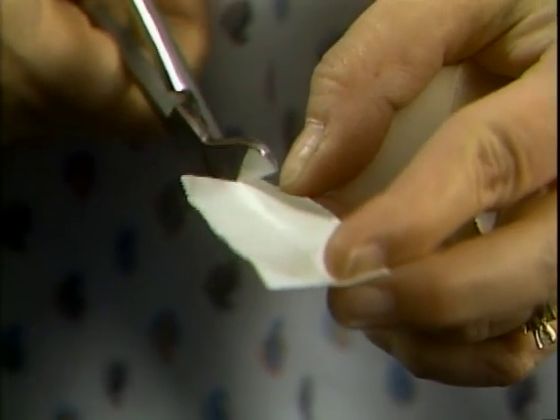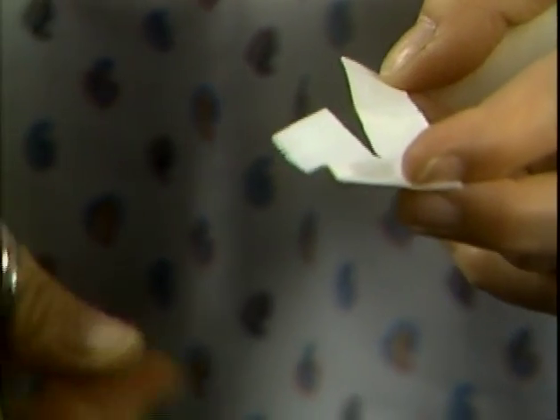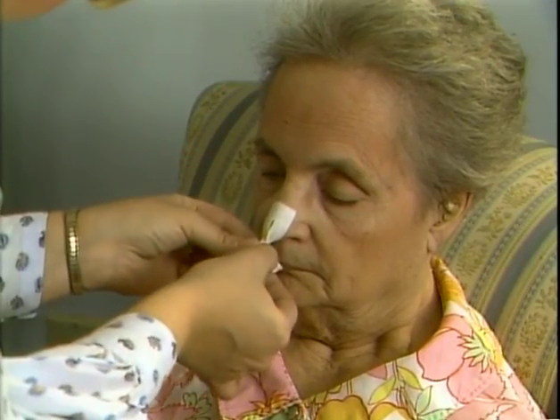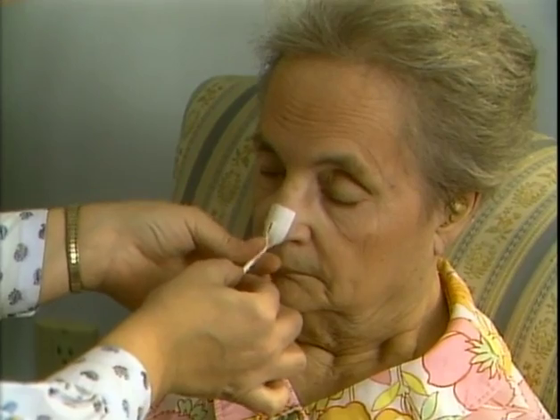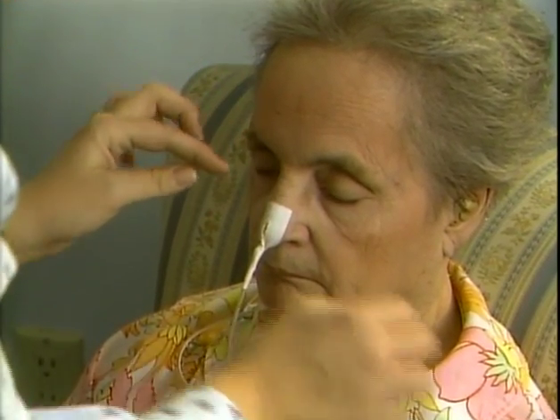To retape the nose, cut 2 pieces of tape, one 3 inches, the other about 1.5 inches. Cut the 3-inch strip halfway down the center. Place the wide part of the strip over the bridge of the nose. Wrap the 2 tails alternately around the tube. Place the second piece of tape over the bridge of the nose. Don't let the tube kink or tape it too tightly.